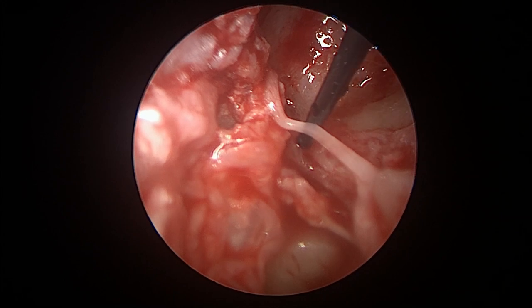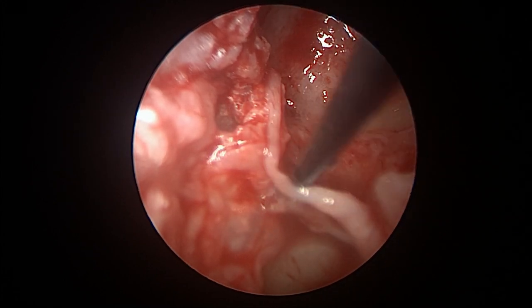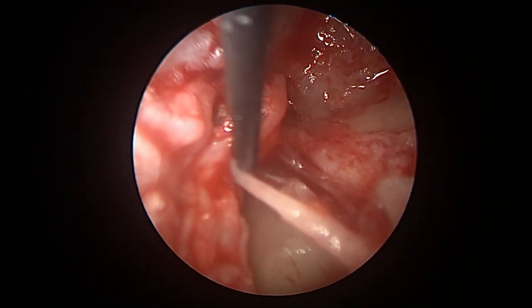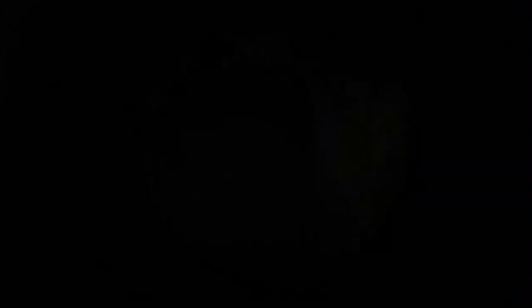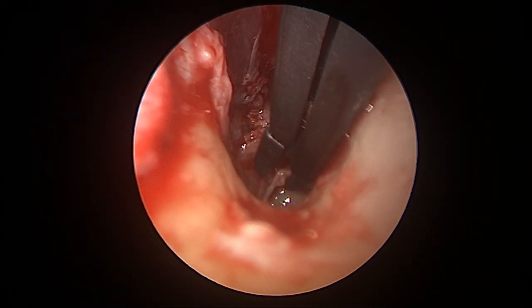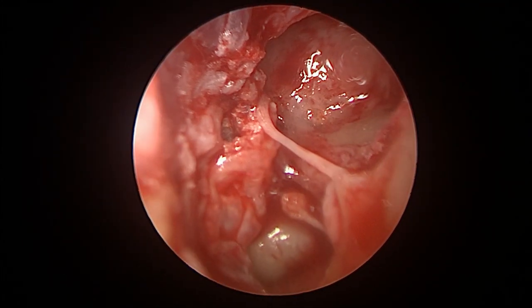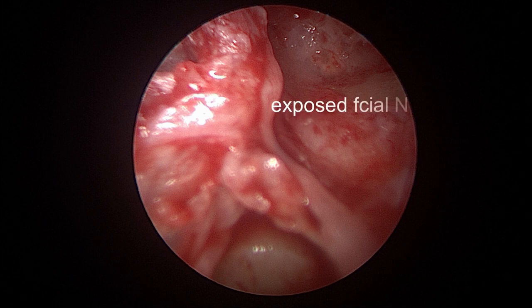At this point we are stimulating the nerve, just cleaning the fibrous tissue around the stapes superstructure. Now you can see the stapes superstructure, the stapedius tendon, the exposed facial nerve, and the chorda tympani.